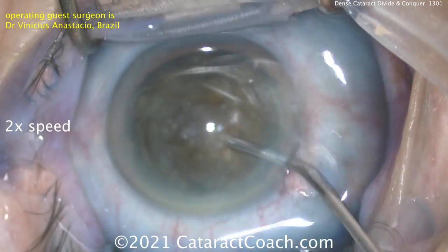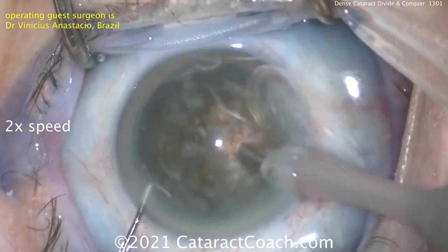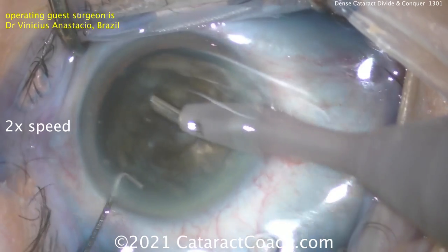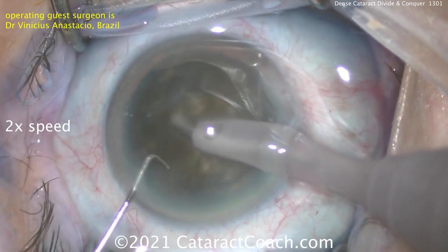A little more viscoelastic going in there. Here comes the phaco probe. So again, it's a divide and conquer technique — cleaning up some of that central cortical material, what little is left there, getting the view. Very dense cataract. Here comes the groove.